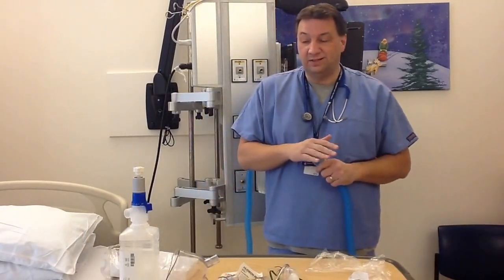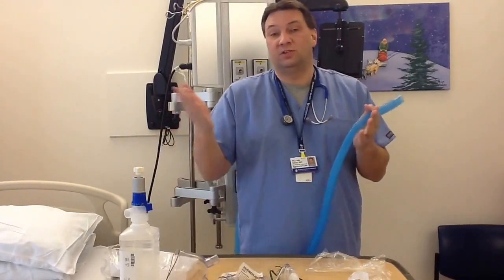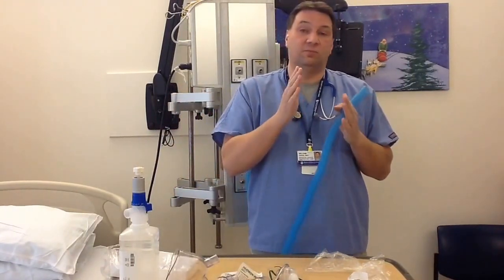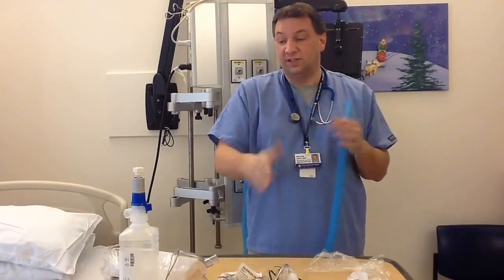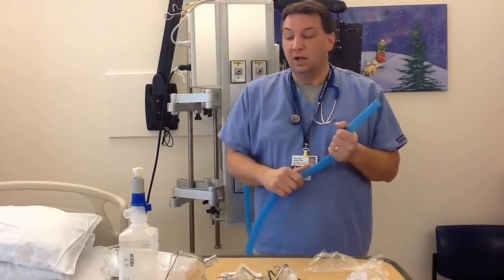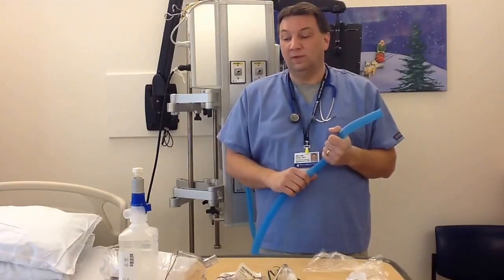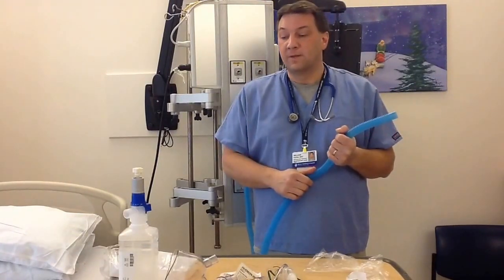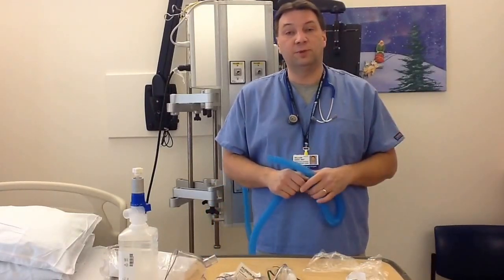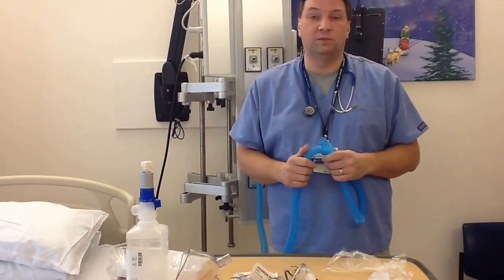One of the biggest things is if you're requiring higher saturations, if oxygen requirements are greater than 50% oxygen, and your patient is satting lower or not seeing improvement on the 40 or 50% oxygen, just let us know and we'll come over and maybe choose a different device, and maybe something's going on with the patient where they need to escalate care. So that's an overview of the aerosol delivery devices here at Boston Children's Hospital. And if you have any questions, feel free to contact a respiratory therapist and we'll be glad to assist you.